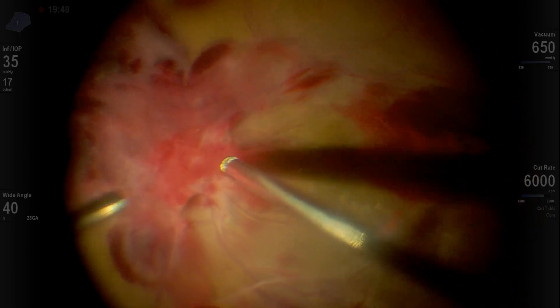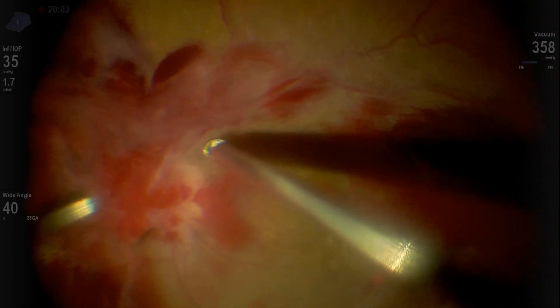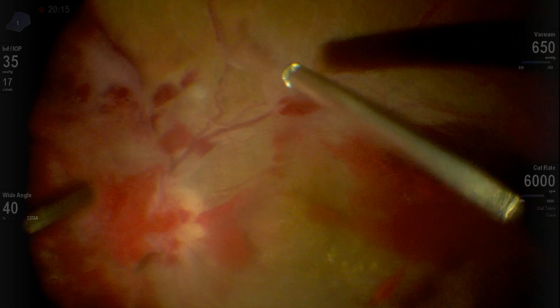Here we're understanding more what's happening and the money shot is to come here, because you need to lift a little bit to be able to access the membrane — it's a judgment call — and this is the lift happening. Now you're in business. You can see now where the retina and the membrane are.